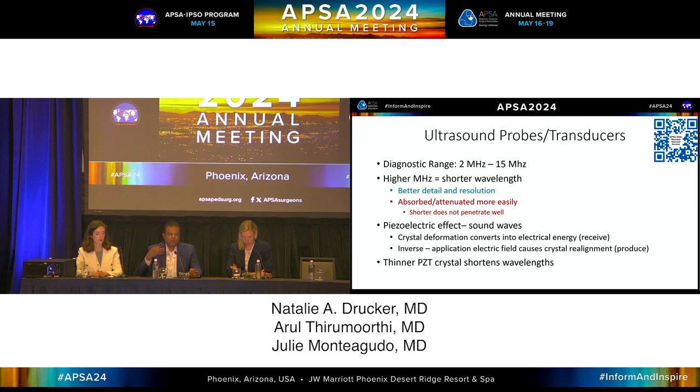But almost always, for all the things that any of us would be doing for vascular structures, we want a high resolution probe because we're really not going to be more than 2 centimeters in for almost anything. And for the purpose of this talk, it's shallow. Maybe you're doing a teenage art line in the PICU. You can use a larger linear probe for that.